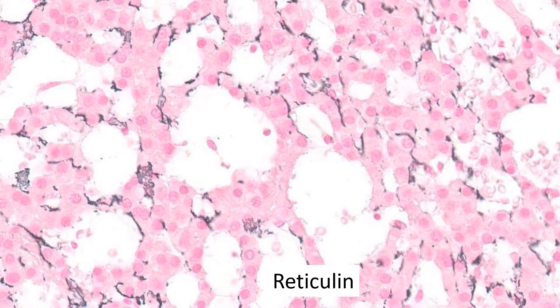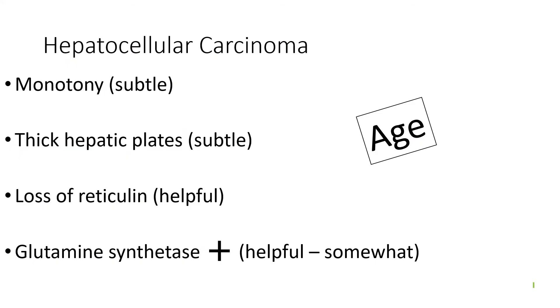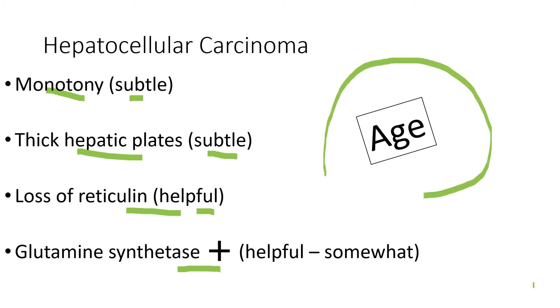This is really helpful — the reticulin stain. It's not the most perfect example of loss of reticulin framework, but there is definitely some loss, and this is the best ancillary test I have. Tallying the evidence: there's monotony, thickened plates — both somewhat subtle — and a significant loss of reticulin fibers, which I'm hanging my hat on. The glutamine synthetase is helpful, though not diagnostic in itself. The patient's age — a large mass in an elderly male — is extremely helpful. Altogether, I feel fairly comfortable calling this an HCC.